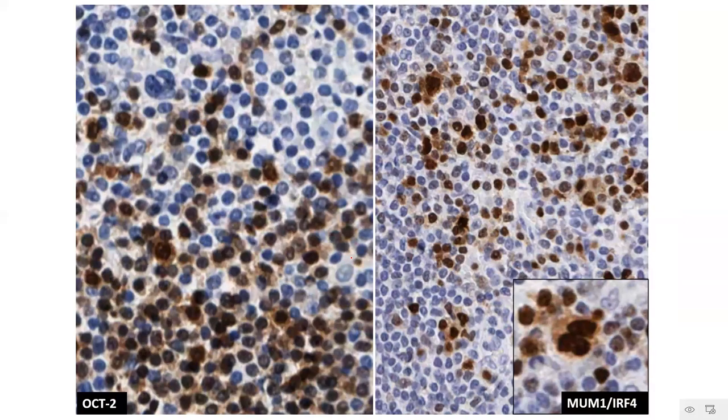OCT2. As we have already said, OCT2 and BOB1 are basically B cell associated transcription factors which will not be present in the case of the Hodgkin-Reed-Sternberg cells. So there is no expression of OCT2, but the background B lymphoid cells are showing nuclear positivity for OCT2. MUM1 IRF4 is a post-germinal center marker which is characteristically expressed in classic Hodgkin lymphoma. So we see a positivity for MUM1 in this case.